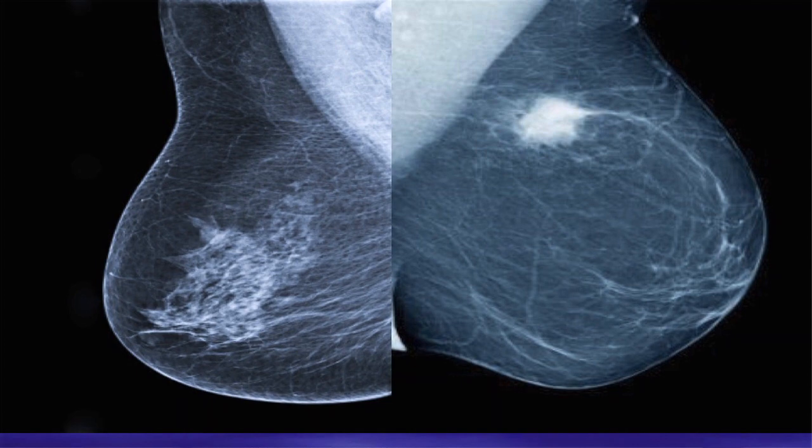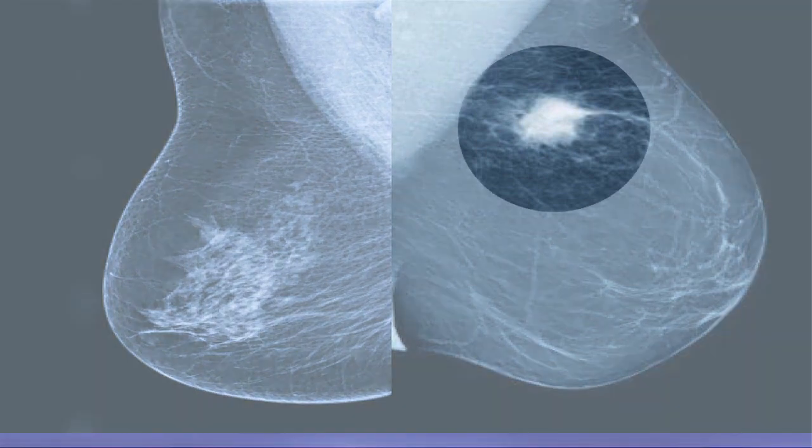This is a fatty breast that probably didn't have a mammogram in a couple of years because this is big. And if it was brand new, we'd expect it in this fatty breast to really be conspicuous when small. So this has either been there a while or it's been growing very rapidly since the last mammogram. I can't tell. Like I said, if there was a mammogram the previous year and it wasn't there, that's growing really fast, and that's really concerning.